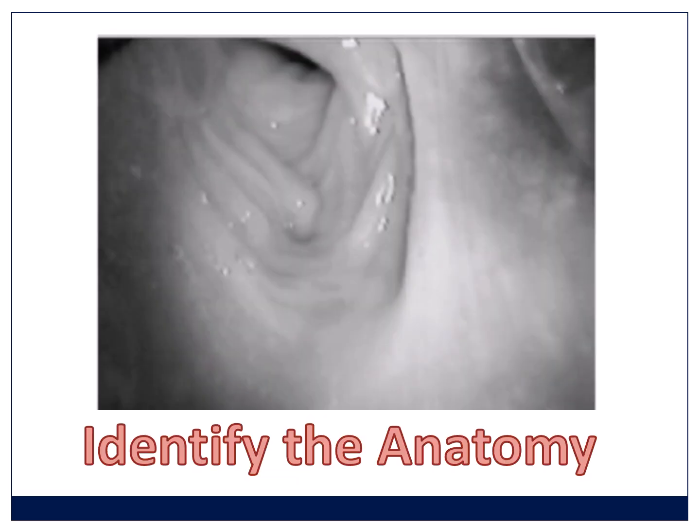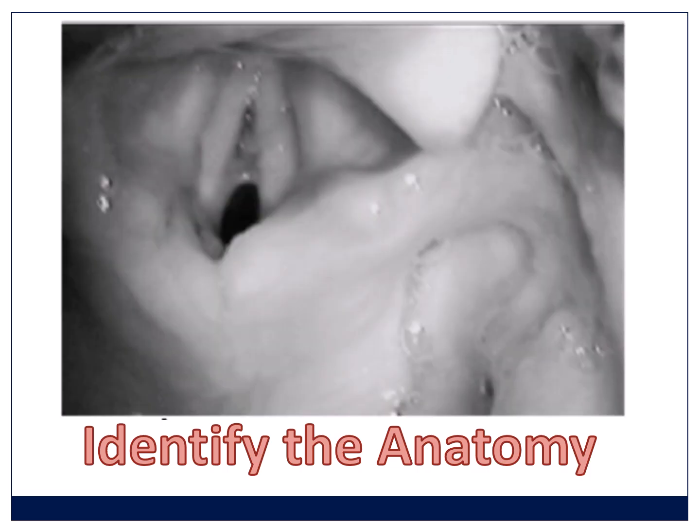So what you need to do is identify the anatomy well. We obviously haven't got it well identified here. There are the cords and the glottis.